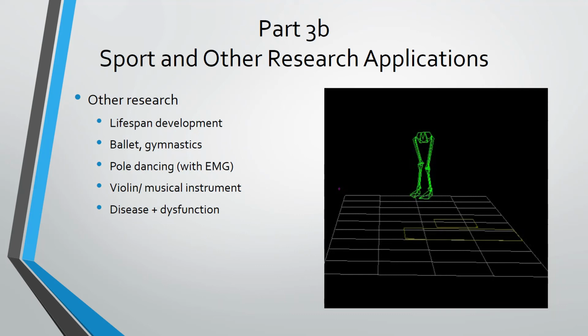Clinical research investigating disease and dysfunction, both the magnitude and the progression of such impairments. So for example, this clip shows the walking gait of a child with cerebral palsy, and through a biomechanical analysis using marker-based motion capture, the biomechanists were able to help advise surgeons on corrective surgeries, which will hopefully lead to an improved walking gait, a more comfortable lifestyle and an improved quality of life.